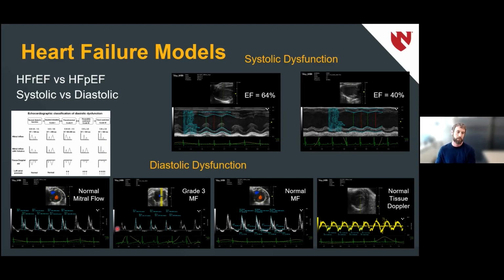We can also use the mitral flow pattern to calculate parameters such as mitral velocity deceleration time, the isovolumic relaxation time, isovolumic contraction time, and aortic ejection time. Together, all of them tell different parts of the relaxation of the ventricle and can build a bigger picture of what's going on with the diastolic dysfunction.